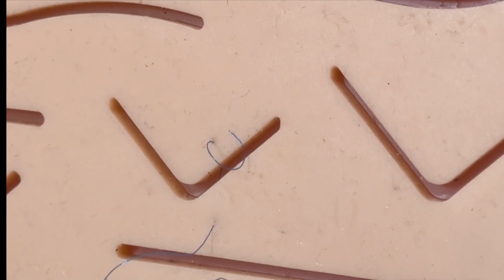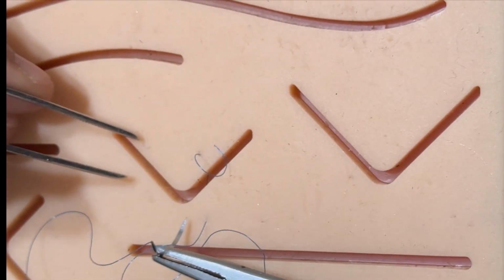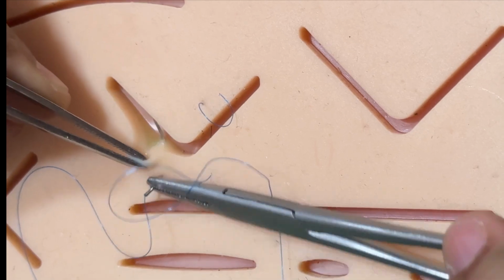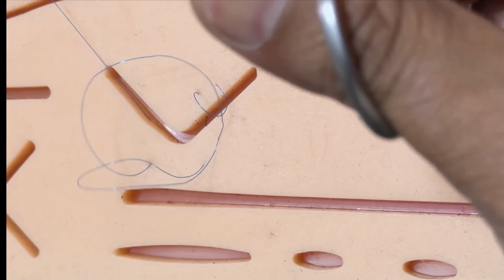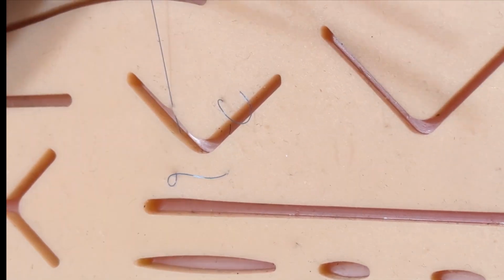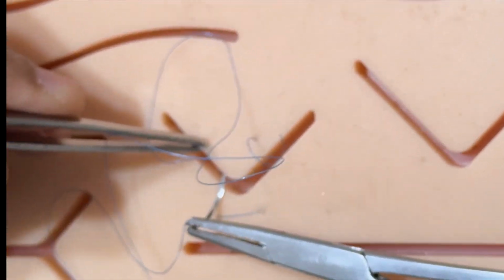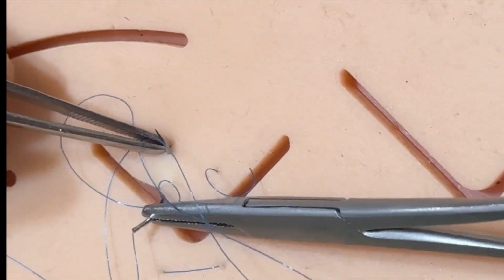Now look at it, I'll reverse the needle as it is a horizontal mattress. Now I'll take the bite exactly in front of this and from this imaginary x distance. So let me take a bite here. Similarly here also we'll be taking the bite.